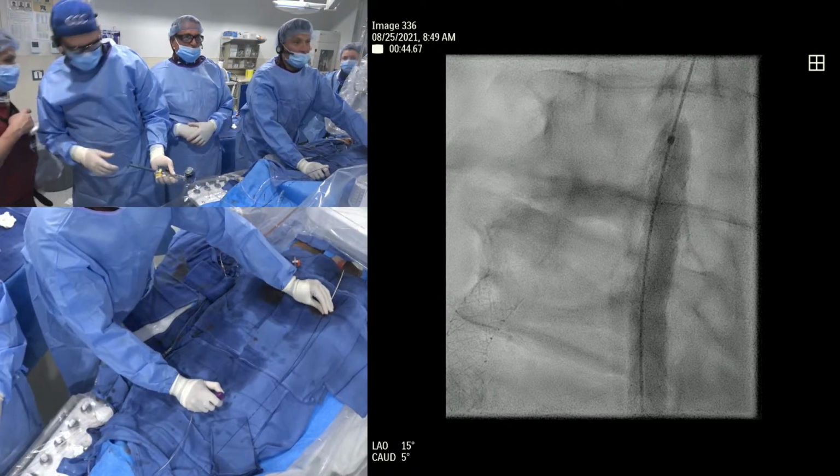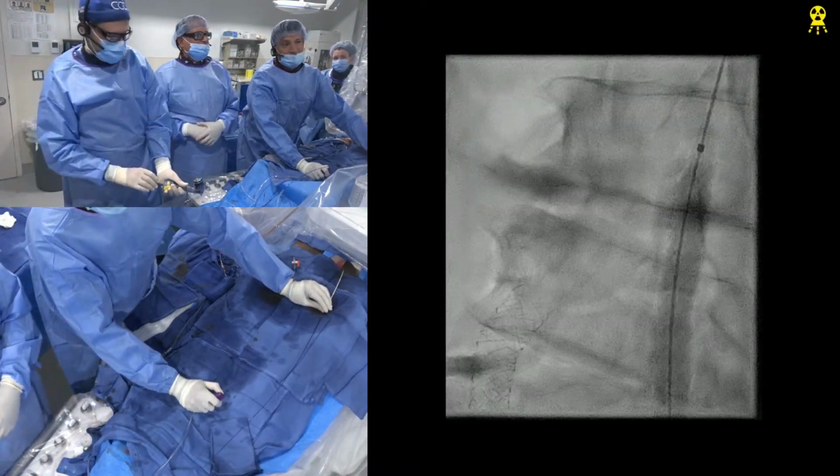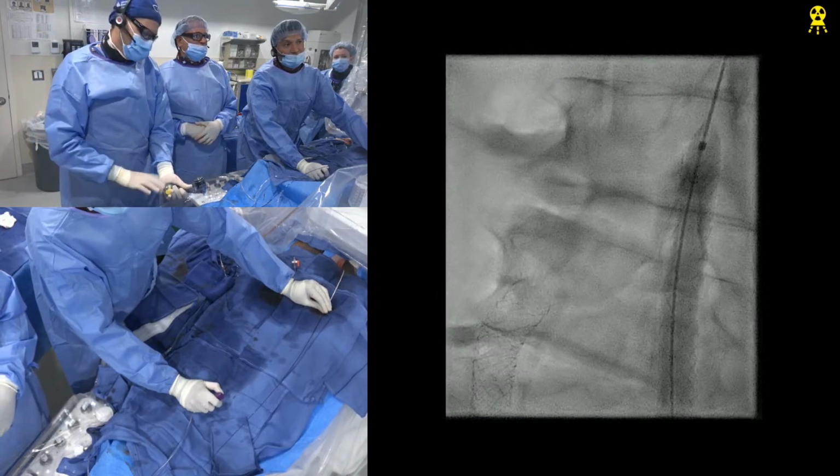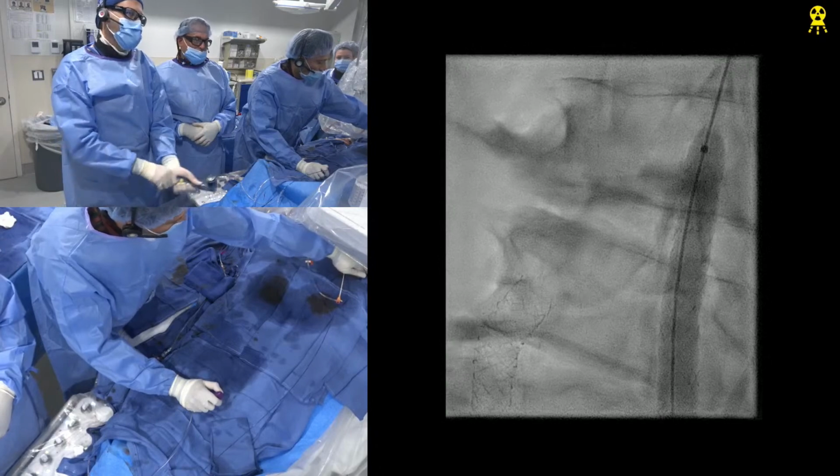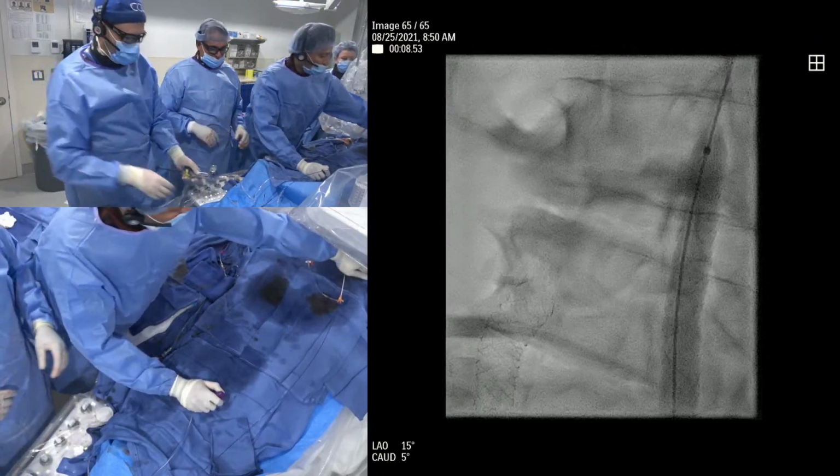It's fine. We have a big loop. Pull back a little bit and then go up. Let's go up to 12. It's fine. Just want to make sure it's up against the wall. Keep your hands down, Patrick. 12. Down. 12. Yeah.